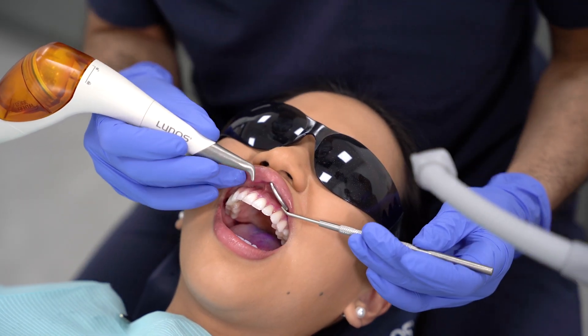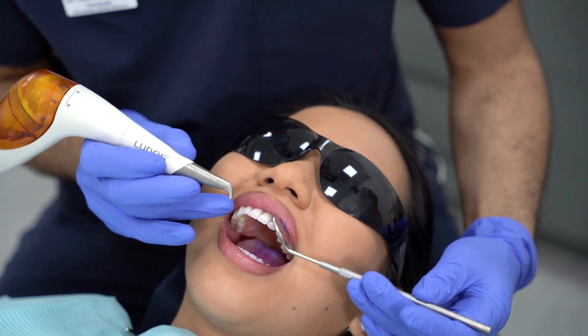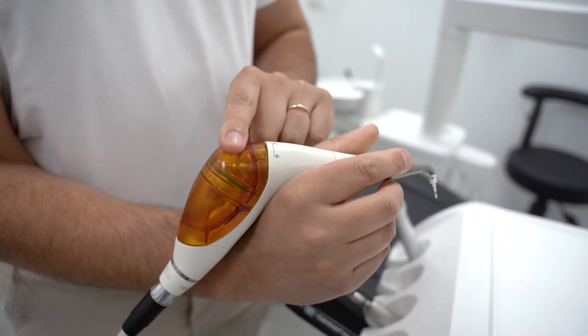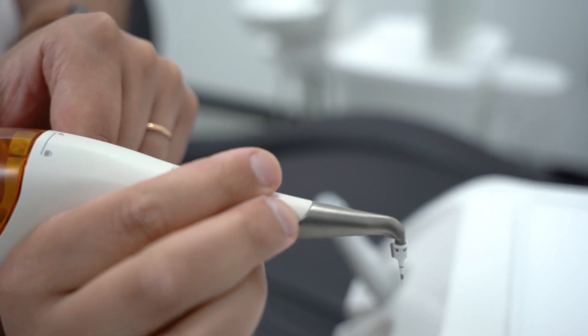Mylinos offers excellent ergonomics for fatigue-free working, with it being designed to sit comfortably over your wrist. The chamber sits close to the body in order to balance the weight distribution, along with the nozzles rotating 360 degrees for ease of access.